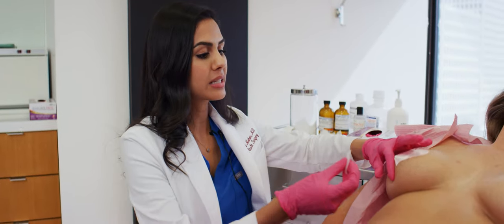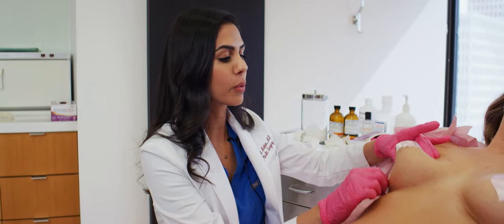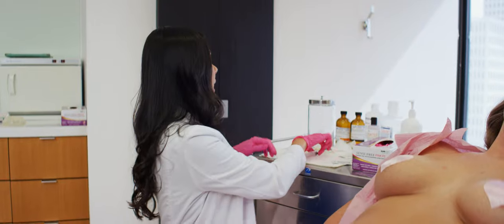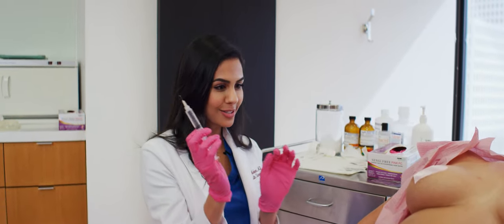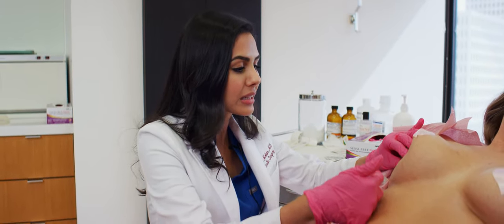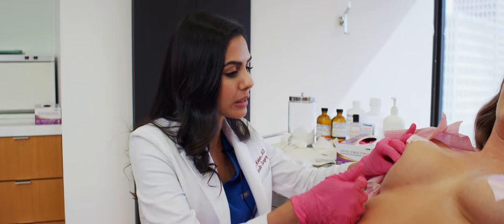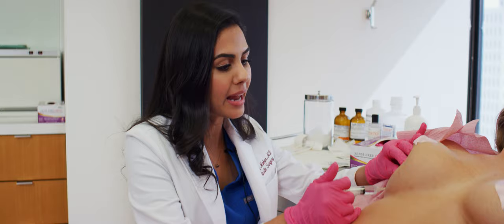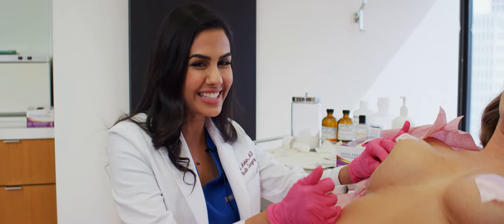All we do is a tiny little bit of alcohol to numb that little area before we do the numbing medicine. This is just a tiny little Botox needle — so all of you have probably had that. We are going to do just a little bit of numbing medicine. It's such a small needle, so just a little poke and a burn, and then after that we are going to do the deflation procedure.